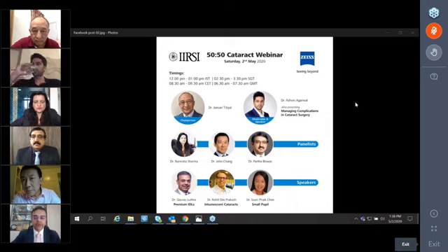I would go with iris hooks, get a little bit of dilation first, and then gently tug on each hook at a time, like 4 hooks, and gradually try to get a pupil which is not too large. Don't aim for a very large pupil. Aim for a mid-sized pupil, which is just enough for you to get in, like a 4 mm pupil is good enough to do your surgery. That way you are not going to damage all the sphincter and have a big pupil later on. And the rings are probably not a great idea in such situations where you are expecting a very tight or a rigid pupil. Iris hooks with a moderate dilation is good enough, I think.